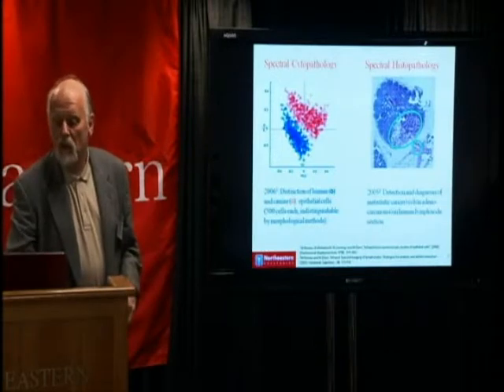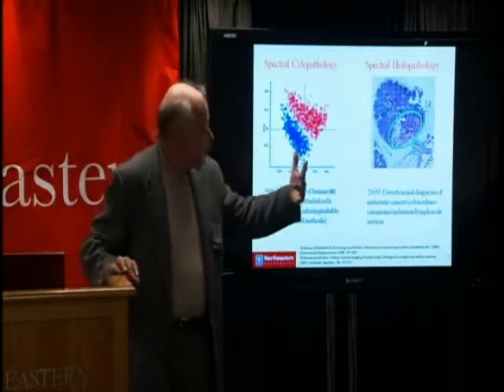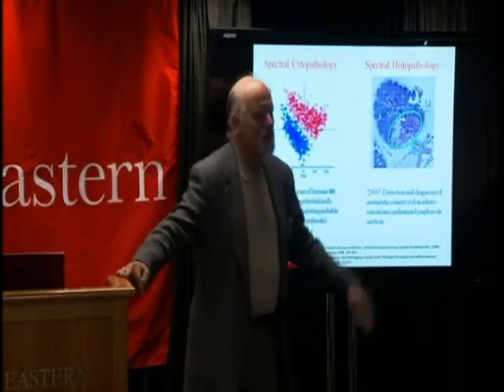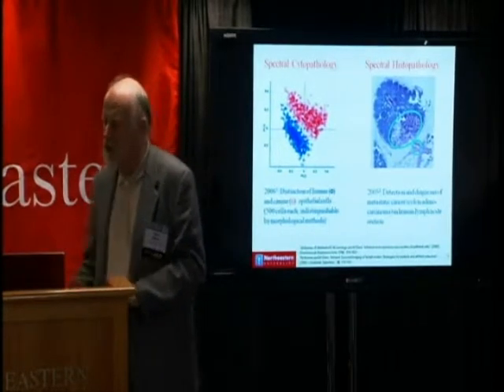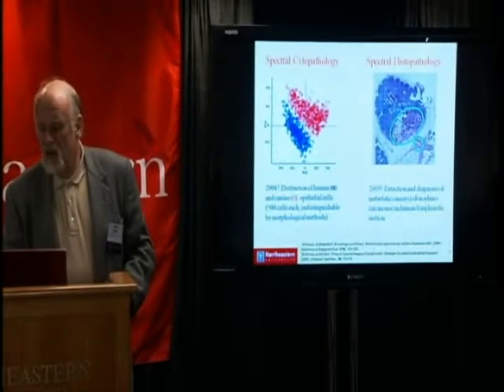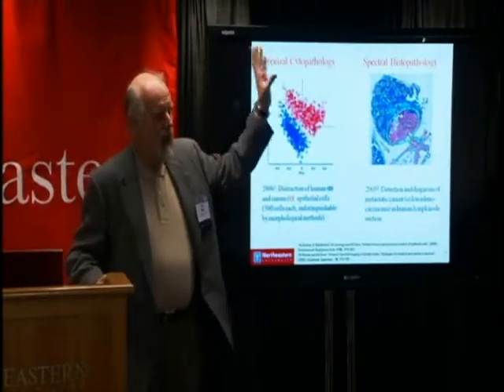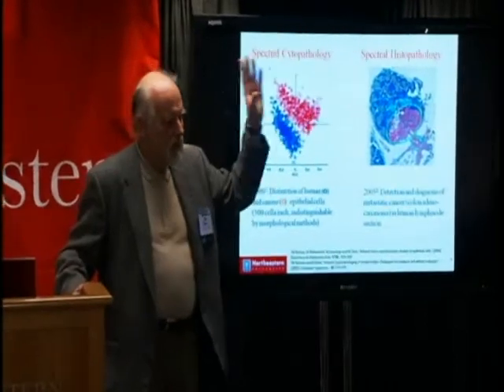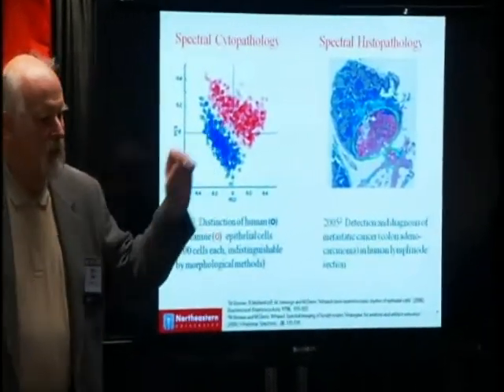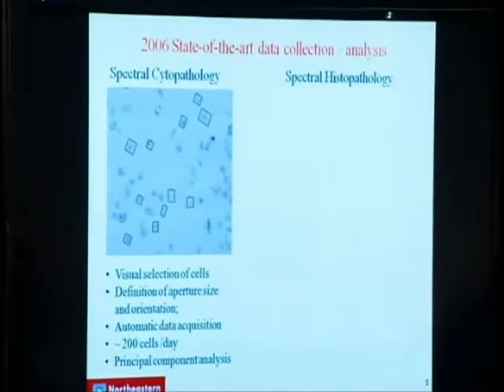And this was one of our first successes in detecting, by unsupervised methods, cancer in the lymph node. This is an excised lymph node, about 10 millimeters in diameter. The area in the green circle is actually the cancer, and our spectral diagnostics very, very nicely, unsupervised, without input from any pathologist, found the tumor. So that was in 2005, 2006.